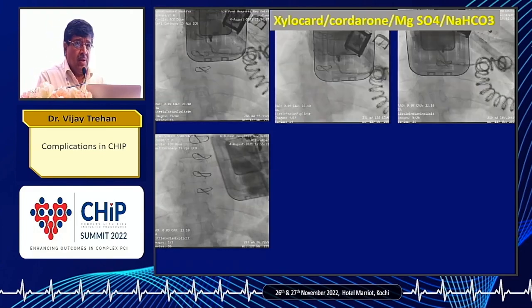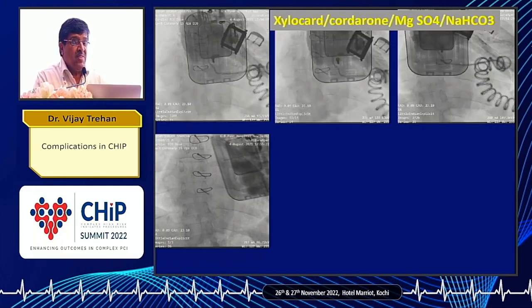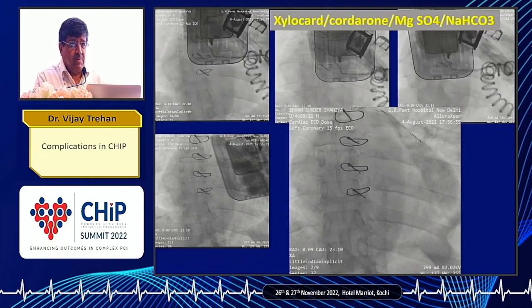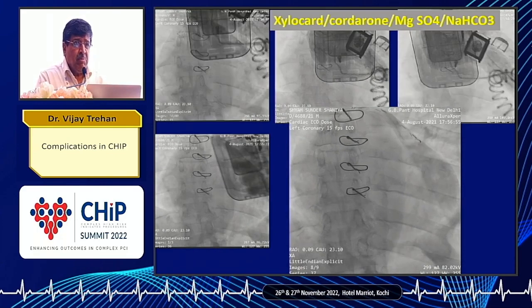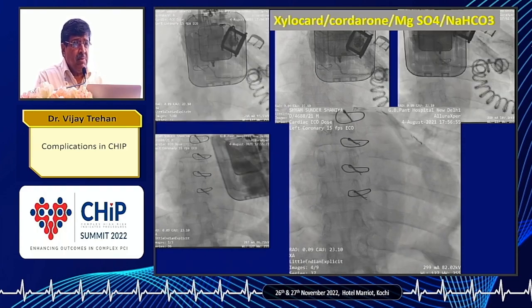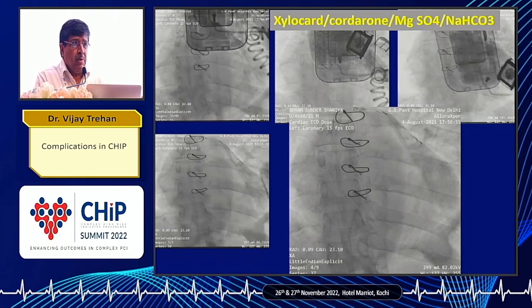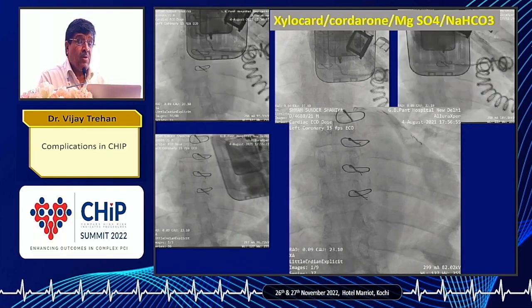So again, it was not a point to get into radial. Now we are getting from bad to worse because these episodes are continuing, and in between, even if I get some rhythm, it is a worsening sinus tachycardia, falling systolic BP, narrowing pulse pressure, and the heart, of course, on the floor, are not doing very well.